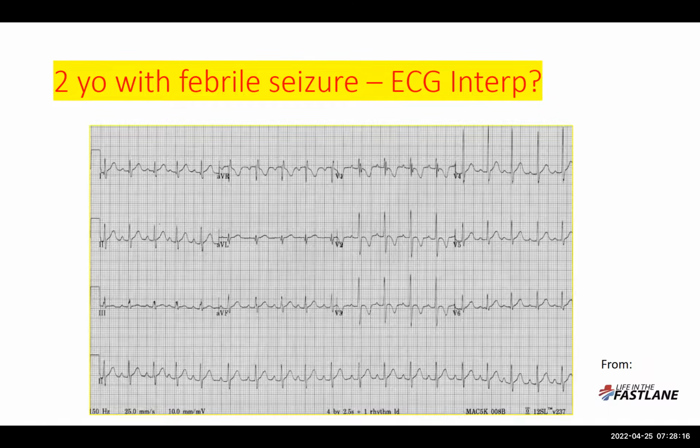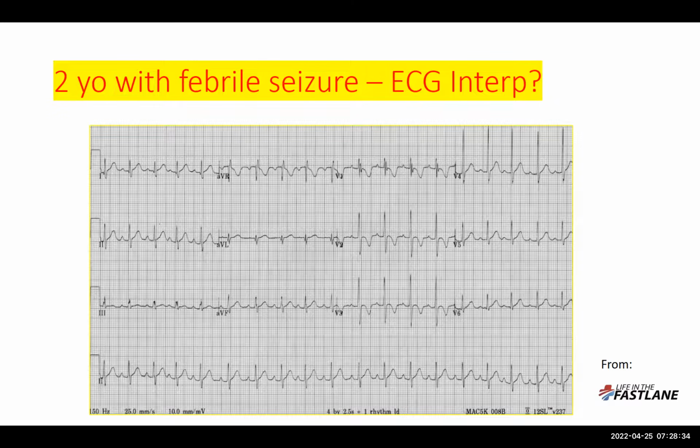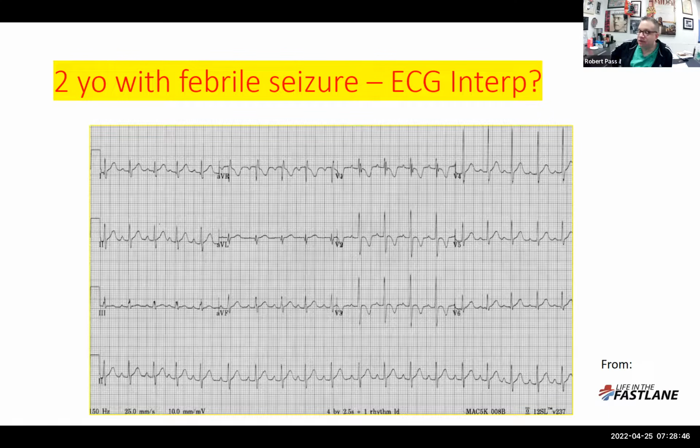And then we'll see if there's any history of the mom having Sjogren disease. Even though it's a long stretch because it's more like a complete heart block. What about the thyroid gland, can it have any impact on nodal conduction? Hypothyroidism too. Also, you'd want to get a SED rate or a CRP to make sure that there's not inflammation, especially if the patient had a seizure. But this tracing is pretty close to normal.